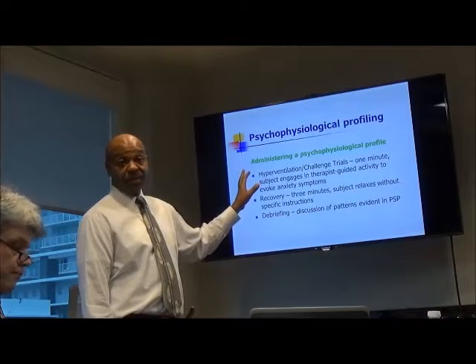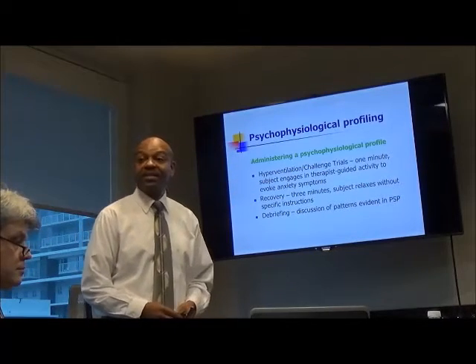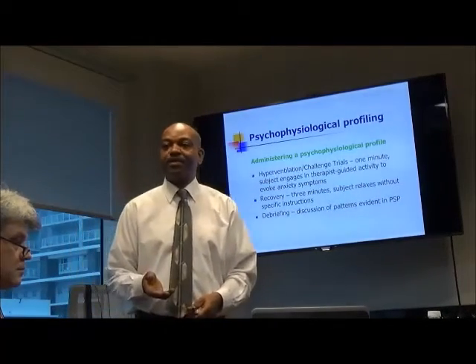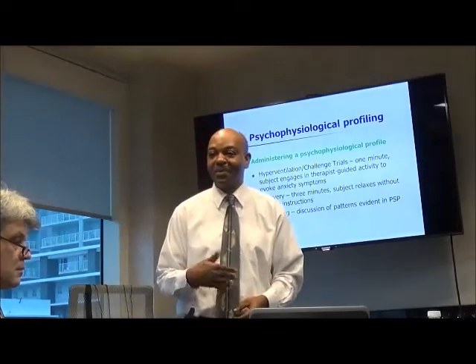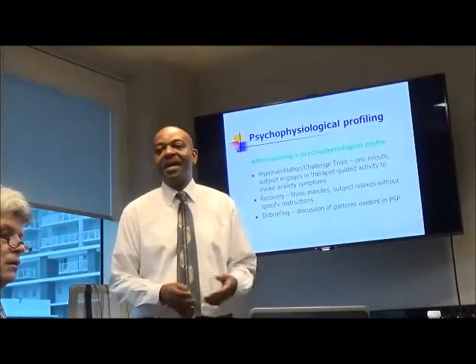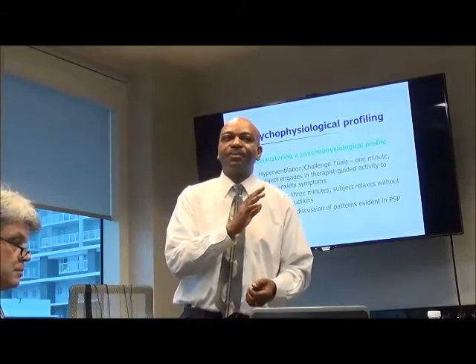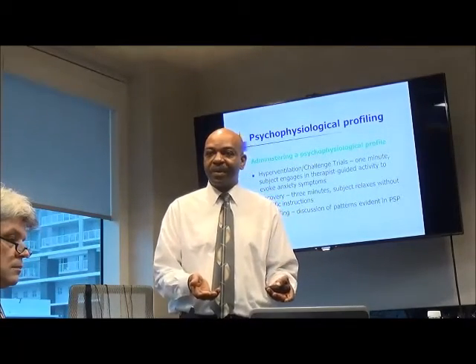This is something I don't do, but in this example, they say a hyperventilation challenge. I don't ask people to hyperventilate because I don't want them to pass out when they're working with me. You also have to take into consideration the setting that you're working in.